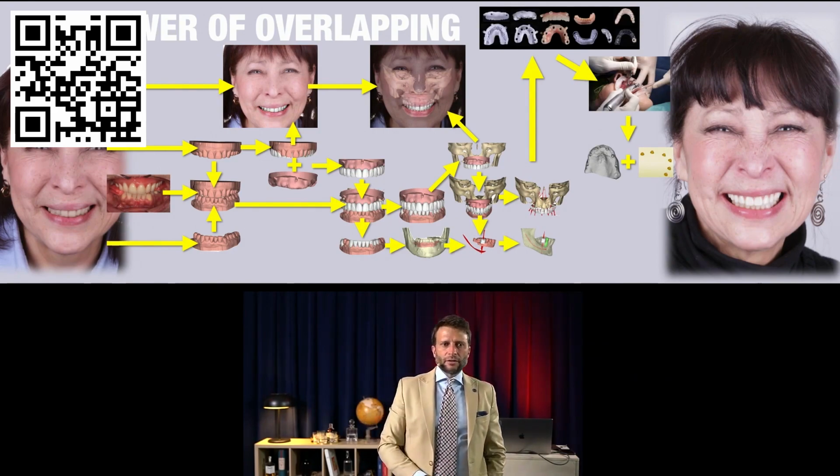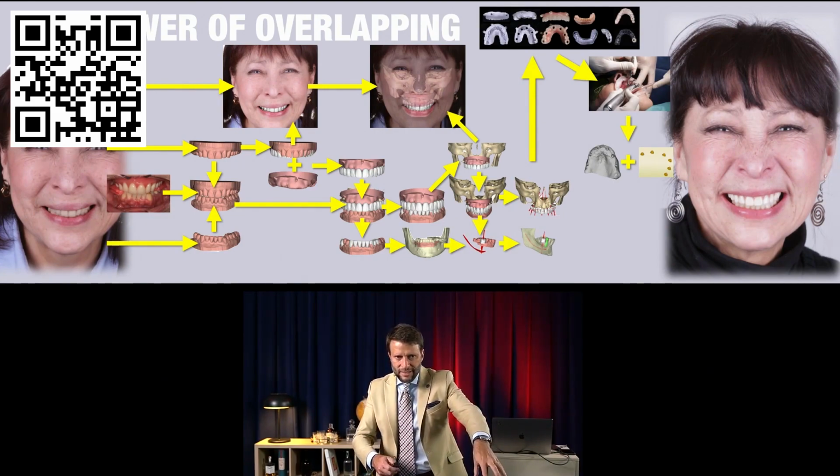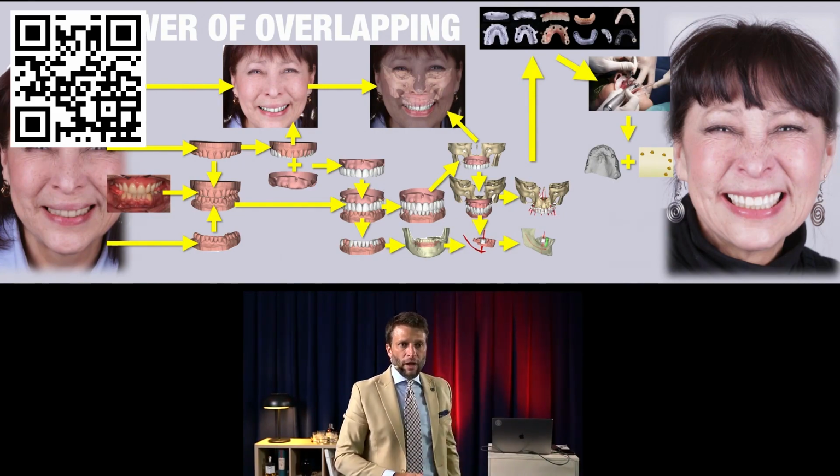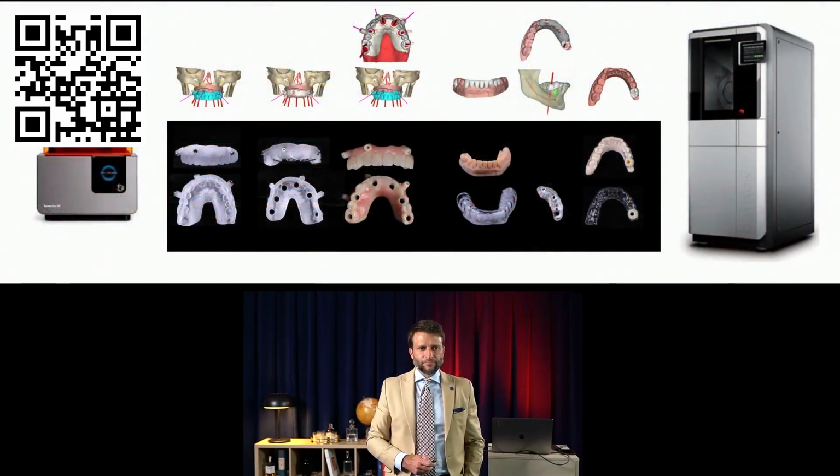So what we did for her on the lower was direct composite, copy paste from the lower design, plus the single implant, but in harmony with the new upper.